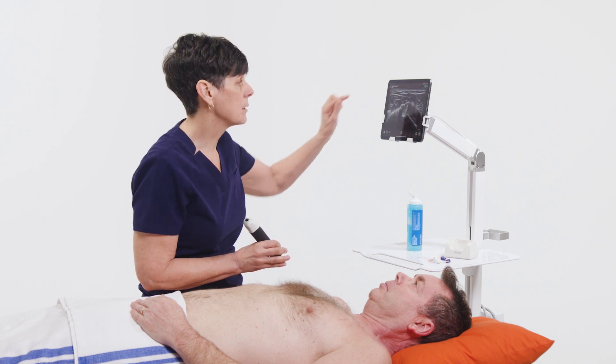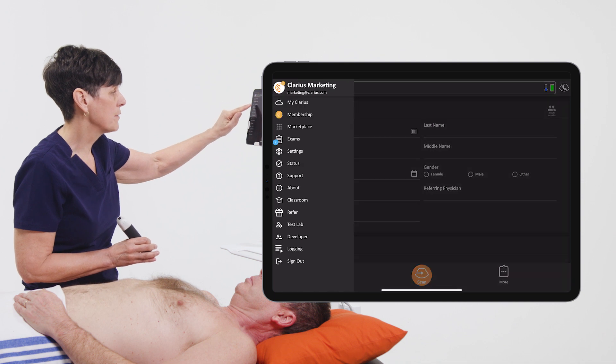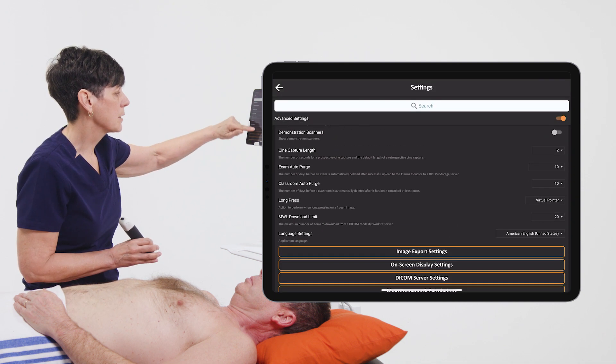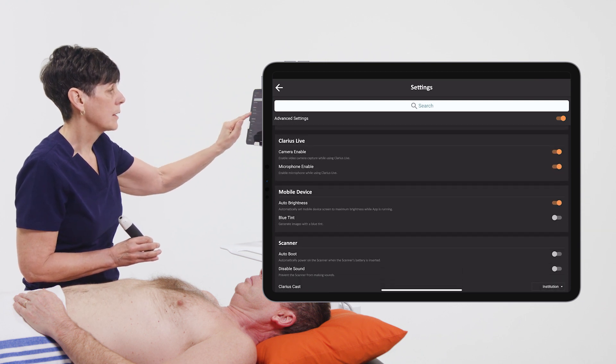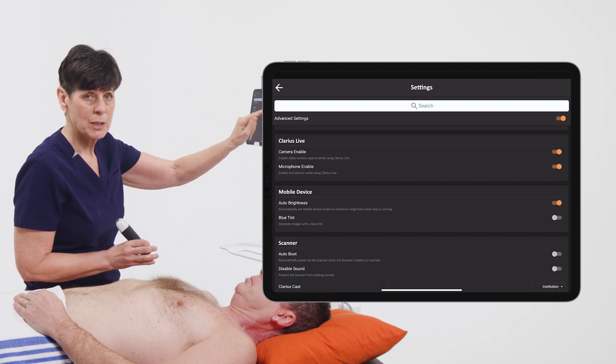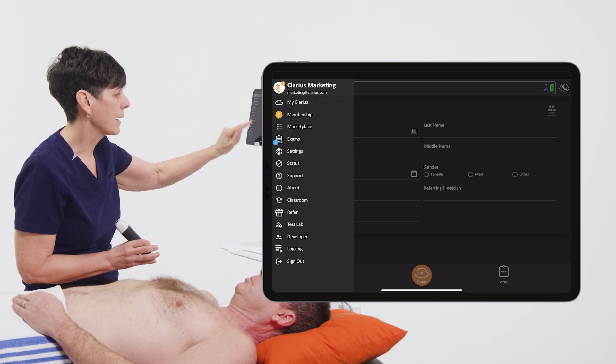What you're going to want to do is go into the settings on your device and search for the Clarius Live section. Make sure that your camera and microphone are enabled, and then hit the back arrow.